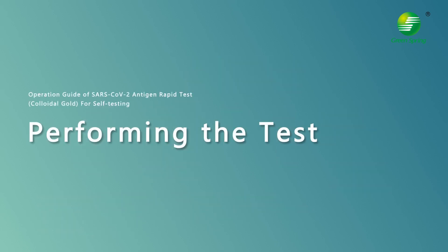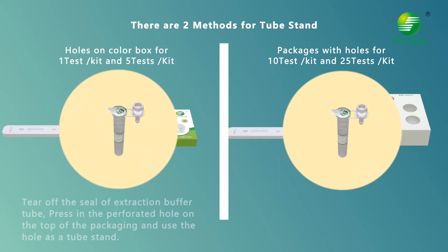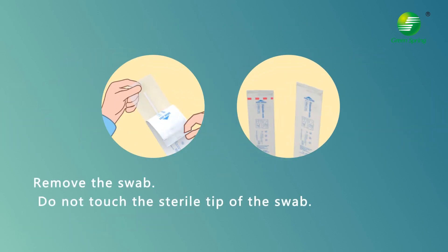To perform the test, remove the test cassette by tearing open the foil pouch and place it in front of you. Tear off the seal of the extraction buffer tube, press in the perforated hole on the top of the packaging, and use the hole as the tube stand. Remove the swab — do not touch the sterile tip of the swab.